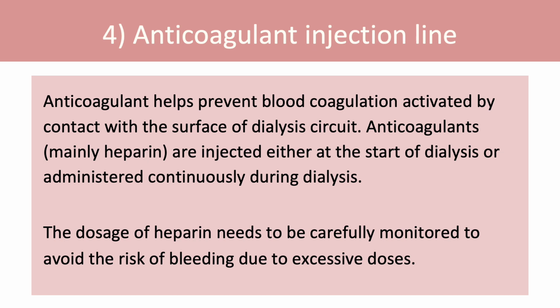Heparin is the anticoagulant commonly used for anticoagulation of blood. The dosage of the anticoagulant must be carefully monitored because an overdose may cause bleeding.